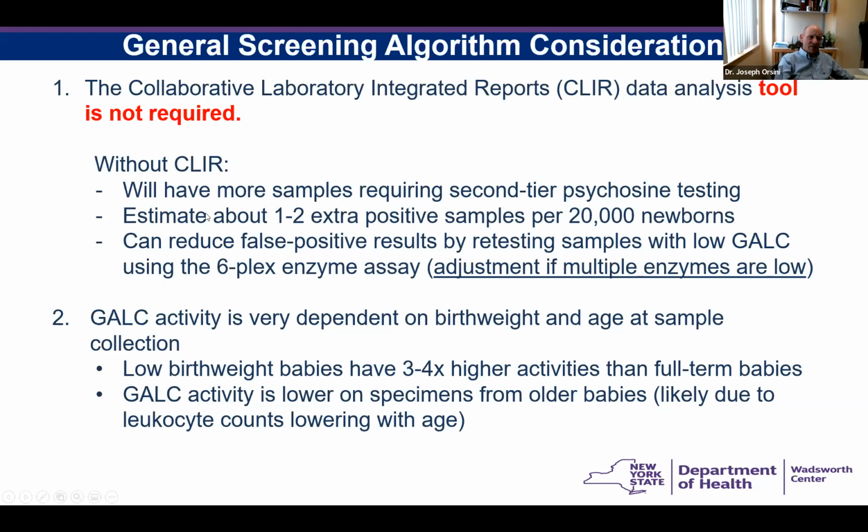Now, I would like to say that you can do this without the CLIR tool, but the CLIR tool definitely helps. But all the other enzymes will help people without CLIR develop screening for Krabbe disease.